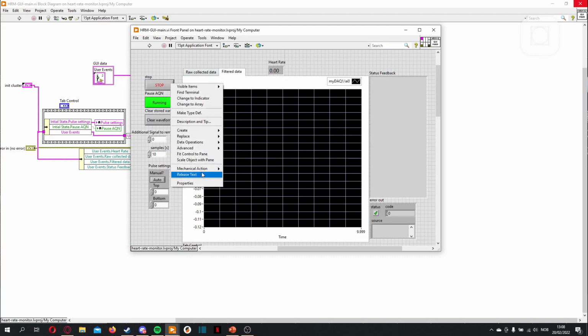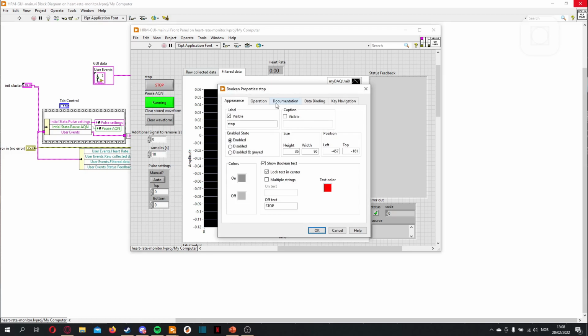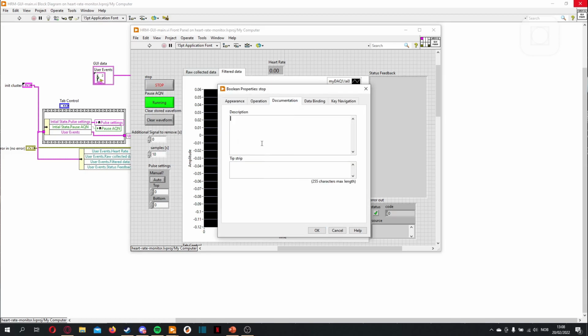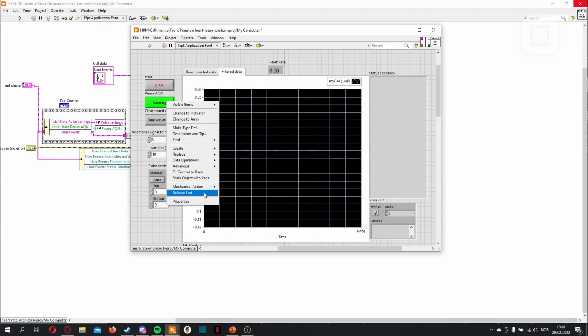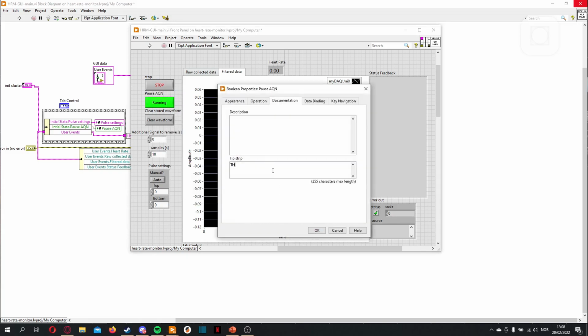Now we want to add some tip strips. What you do is you go into properties here and documentation. This is just, well, anything, while this one will show up when you hover over the button. Let me give you an example. This button stops the whole application. Now, when we hover over this, we'll get this message. This button allows the user to pause the acquisition.